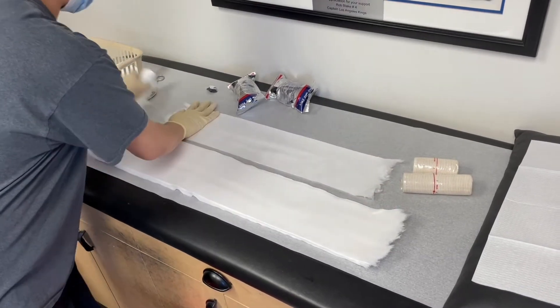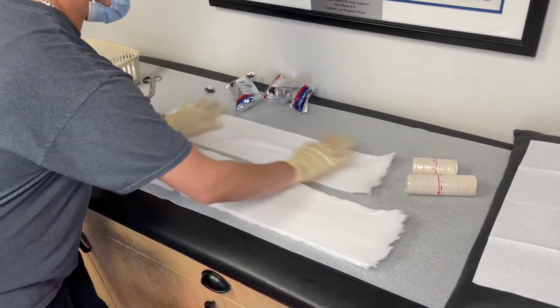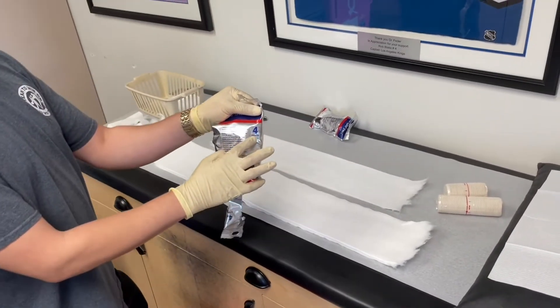We'll have about two or three layers of padding just to cover the fiberglass. We'll be using four inch fiberglass.